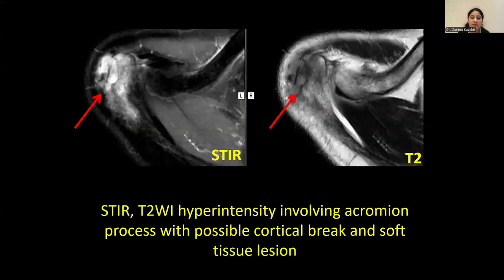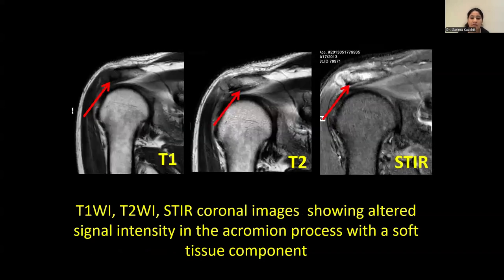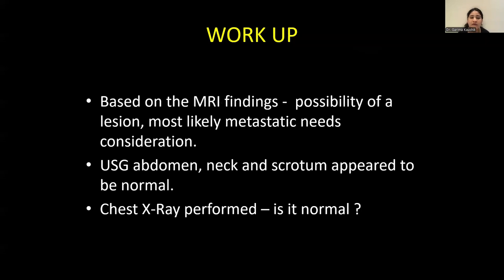These are the T2 and STIR-weighted images which show hyper-intensity involving the acromion process with possible cortical breach and soft tissue lesion. Further, T1, T2 and STIR coronal images show altered signal intensity in the acromion process with a soft tissue component within. Based on these MRI findings, possibility of a lesion most likely metastatic meets consideration.